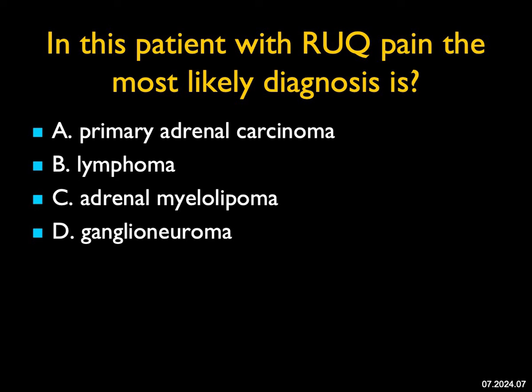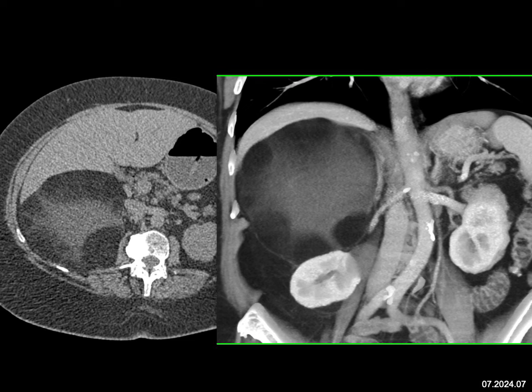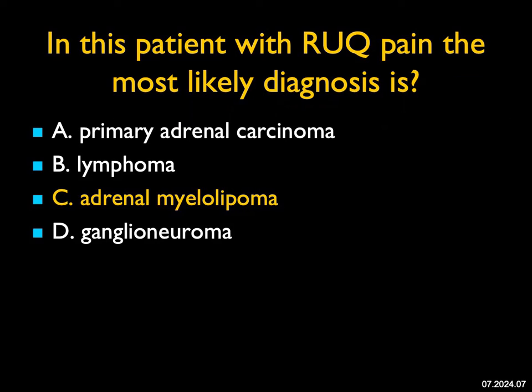In this patient with right upper quadrant pain, what's the most likely diagnosis? Looking at this mass in the adrenal — it has some higher density centrally, but it's mainly fat, and that's going to be an adrenal myelolipoma. The high density is going to be hemorrhage. With adrenal myelolipomas, they're typically resected when they're 5 centimeters or larger because of their propensity to bleed, and this was eventually resected. It's not a ganglioneuroma, which is solid. It's not lymphoma, which is solid. ACCs occasionally can have some fat, but that's usually related to extensive extension into the perirenal and periadrenal space. This is a very nice example of what I would call a giant adrenal myelolipoma.